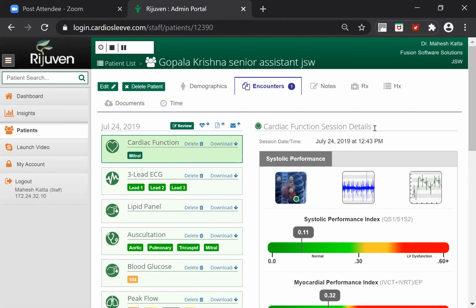Please, members, if you have any question, but maybe before you come, let me ask: on average, how long do I spend on a patient with this device? How long in getting all the things I need? That depends. For example, I showed you vitals. I showed you the dashboard in the application, right?